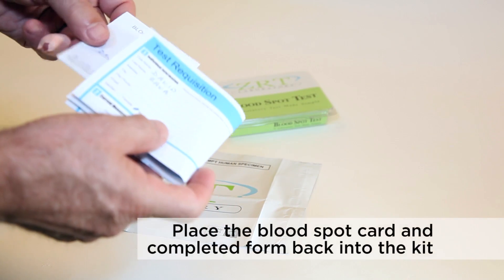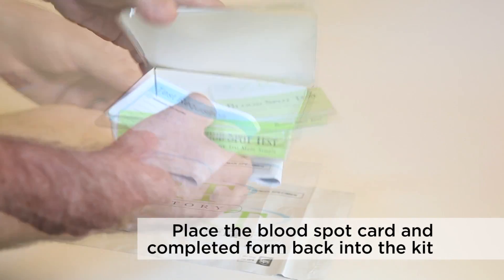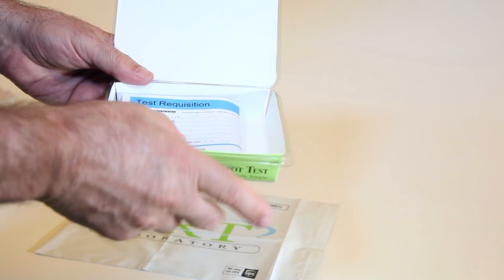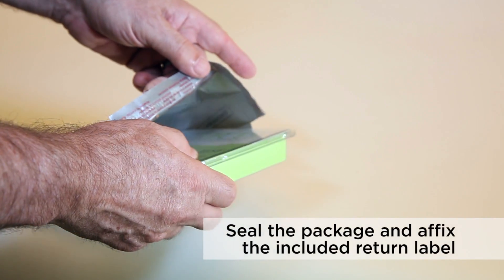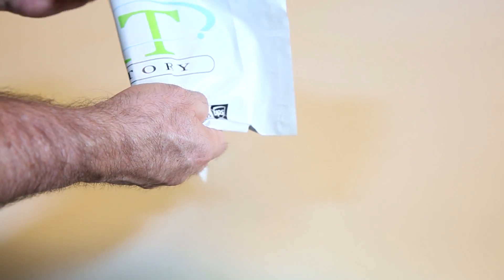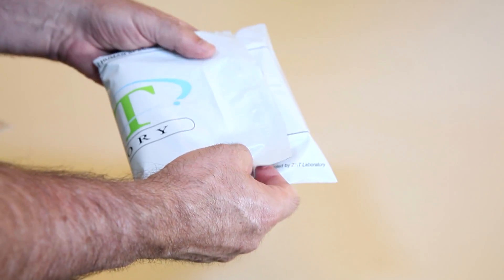Place your card, the completed requisition form, and appropriate paperwork in the return packaging provided. Your final step is to apply the return label provided and then take the sample in the return package to the appropriate mailing or shipping drop-off site.